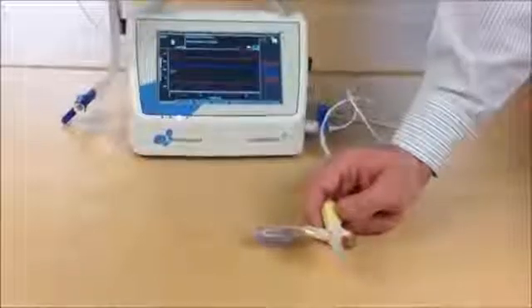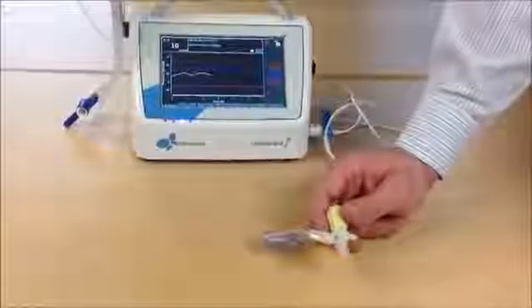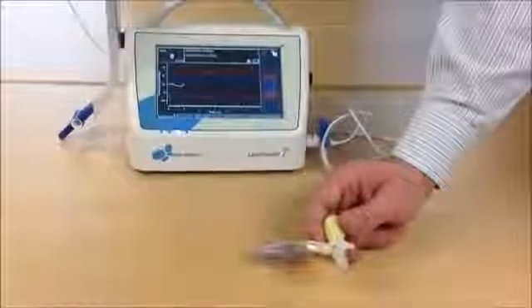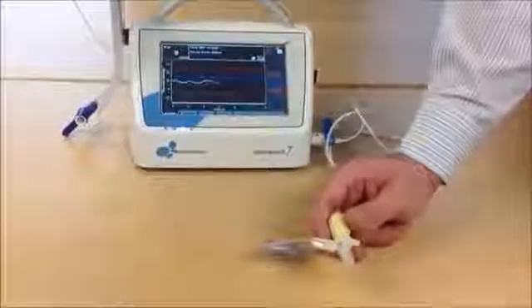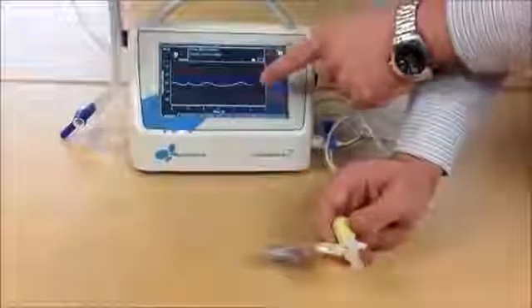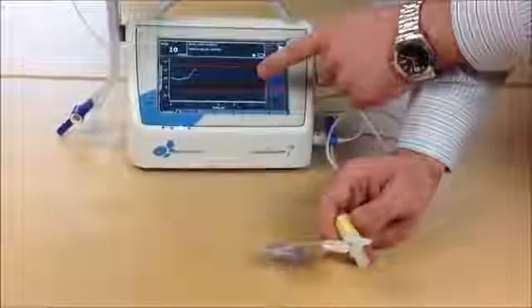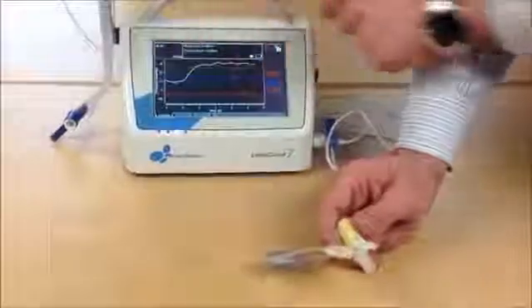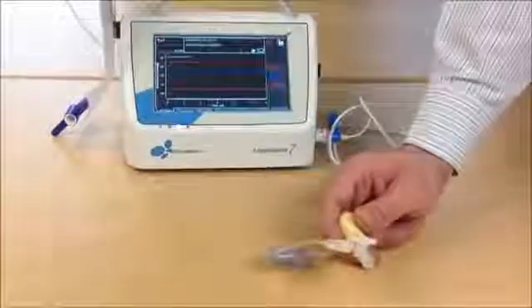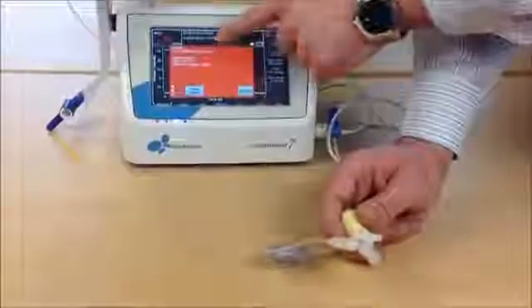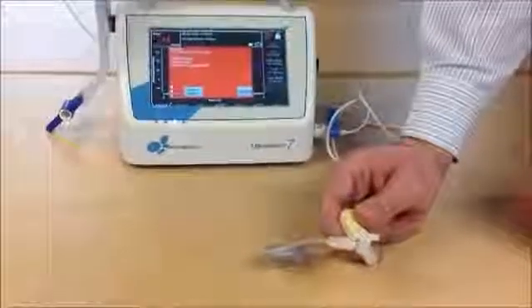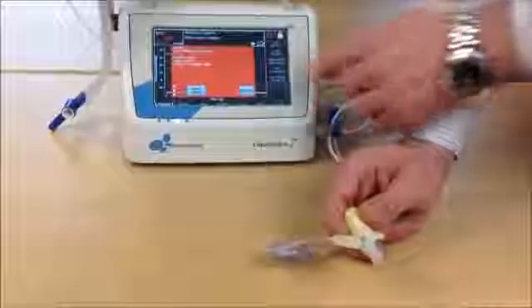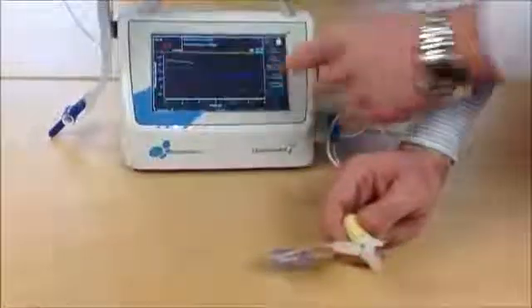The next alarm situation is a high pressure alarm. I can generate some high pressure by pressing this ball. Have a look at the white curve. Now the pressure goes up. The figure goes to red. And we hear an alarm saying the pressure is too high, indicating possible alarm causes.